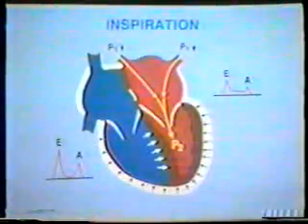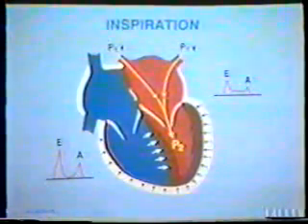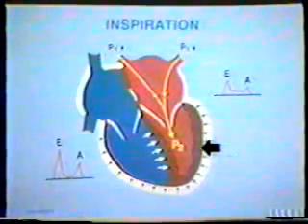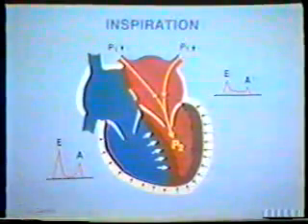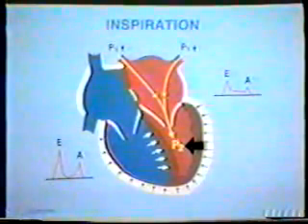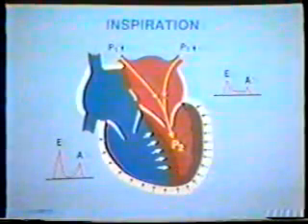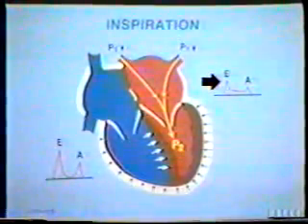Attention to the respiratory cycle is critical when identifying patients with constrictive hemodynamics. With inspiration, there is a normal fall in pulmonary venous pressure, but the change in intrathoracic pressure is not transmitted across the thickened pericardium to the left ventricle. Since the pulmonary venous pressure falls and the LV diastolic pressure is unchanged, there is a decrease in the diastolic filling gradient with inspiration. Because the filling gradient determines the magnitude of mitral velocities, we see a reduction in mitral velocity with inspiration.